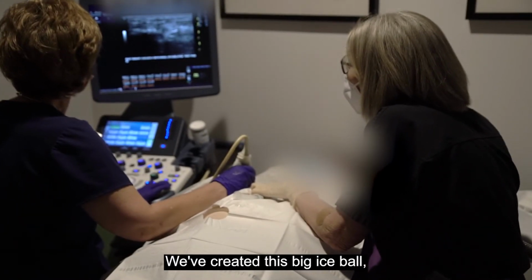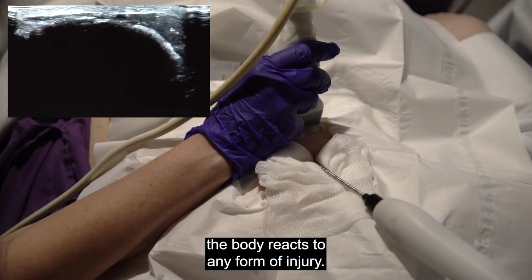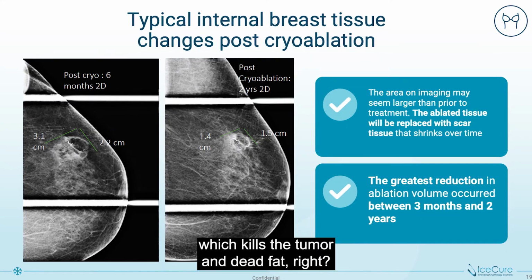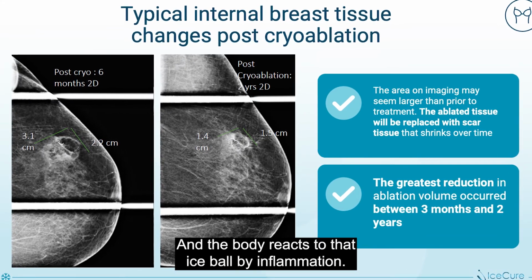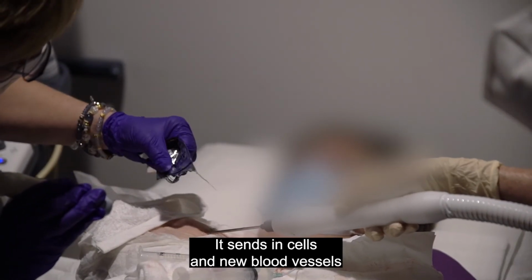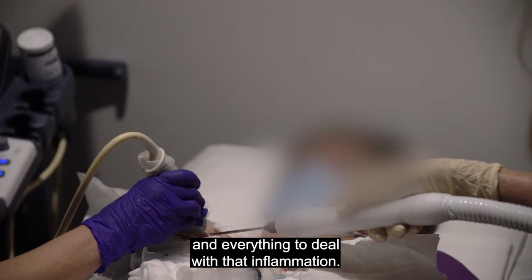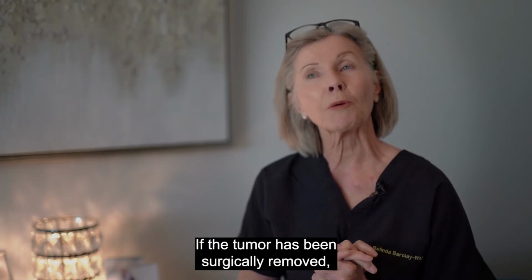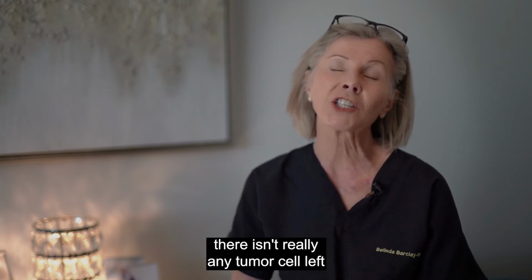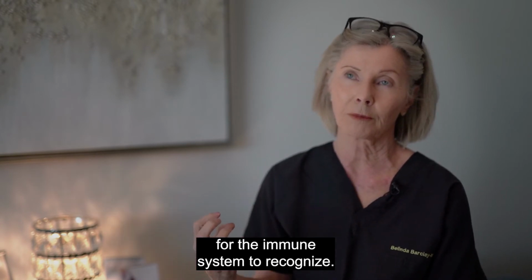We've created this big ice ball. The body reacts to any form of injury. So we've created an ice ball which kills the tumor and dead fat, right? And the body reacts to that ice ball by inflammation. It sends in cells and new blood vessels and everything to deal with that inflammation. If the tumor has been surgically removed and you're then sterilizing the area with radiation, there isn't really any tumor cell left for the immune system to recognize.